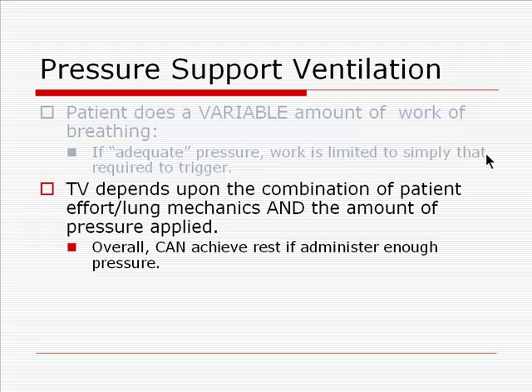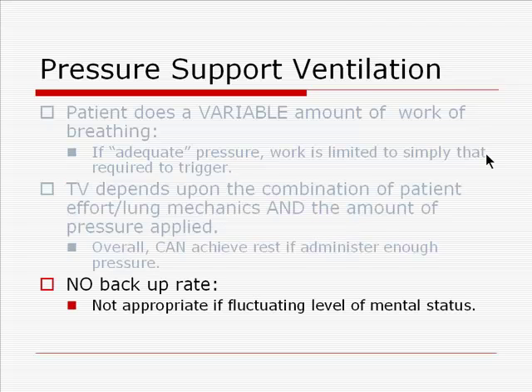In pressure support ventilation, the tidal volume depends entirely upon the combination of the patient effort and lung mechanics and the amount of pressure applied. Overall, one may achieve rest if you administer enough pressure, but one could also induce fatigue if one does not administer enough pressure. In addition, in most mechanical ventilators utilizing pressure support ventilation, there is no backup rate, and hence this would be a mode of ventilation to avoid in patients with a poor or fluctuating level of mental status, in that those patients may not actually trigger the ventilator.